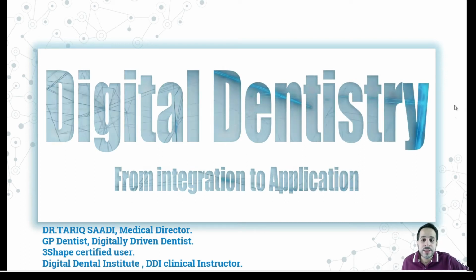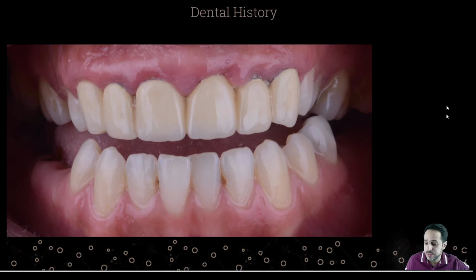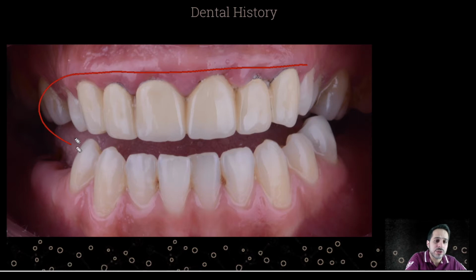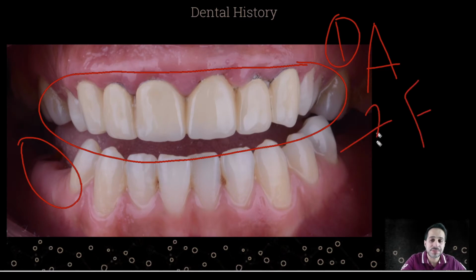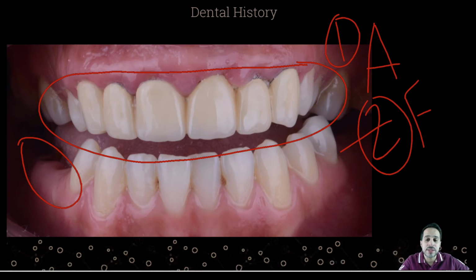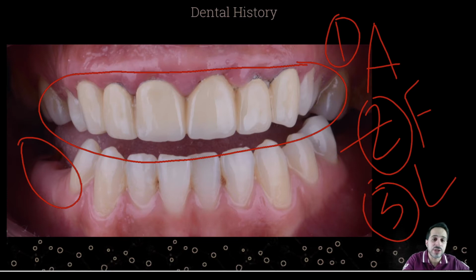Hello everyone, another case. This patient came to our office again for an aesthetic reason. She's complaining about her old bridge, so aesthetic. Then one more thing, posterior, so function, and as well longevity. She already had an old bridge, as you can see here, a defective old bridge.